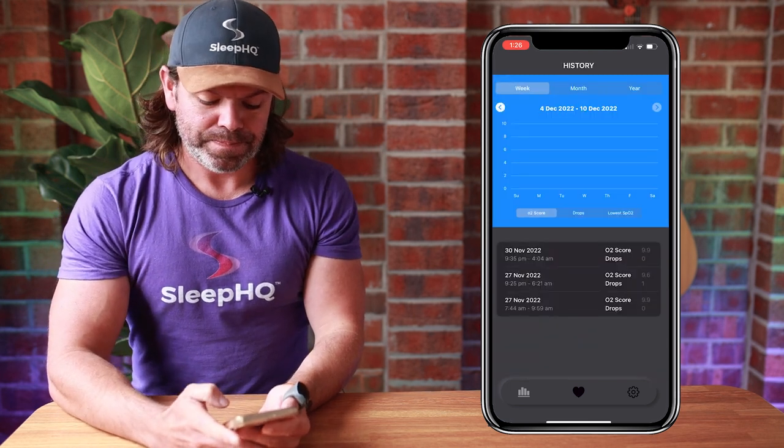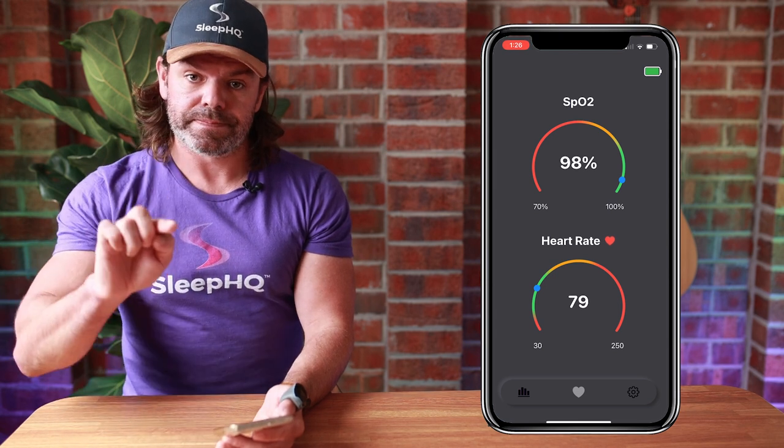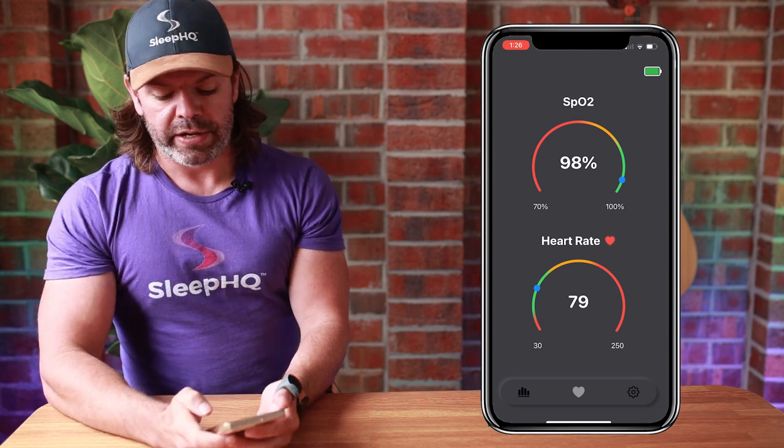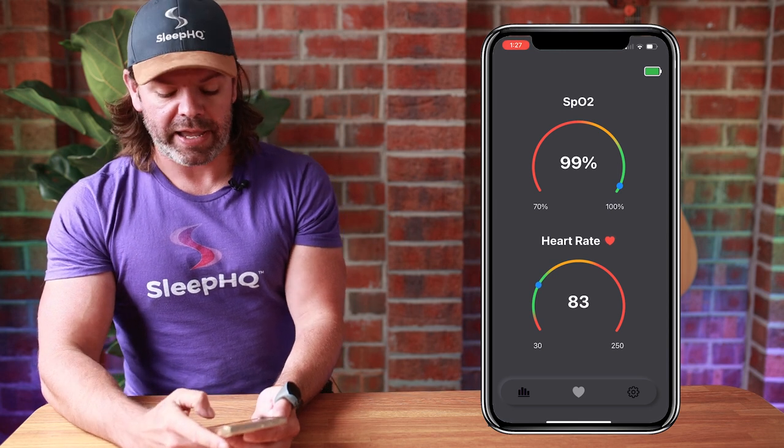If we go across to the heart tab, we can view our blood oxygen level and heart rate in real time. You can also see a colour gradient going from red to orange to green — obviously you want to be in the green zone. We can also see the battery indicator up in the top right.